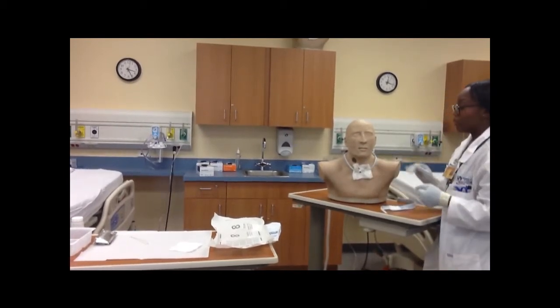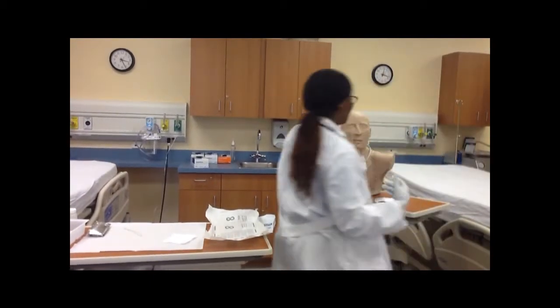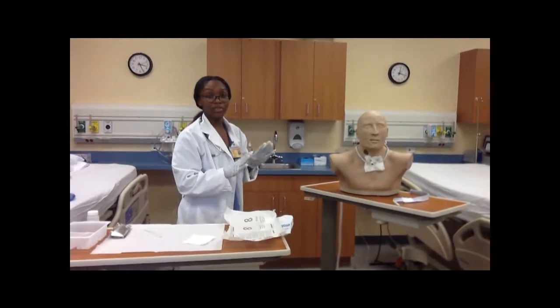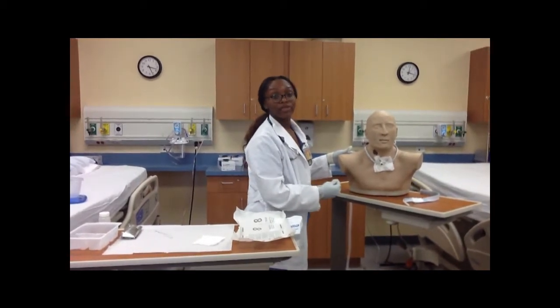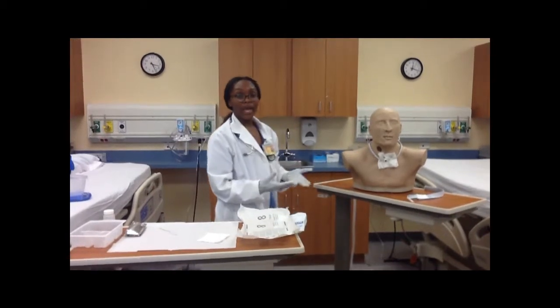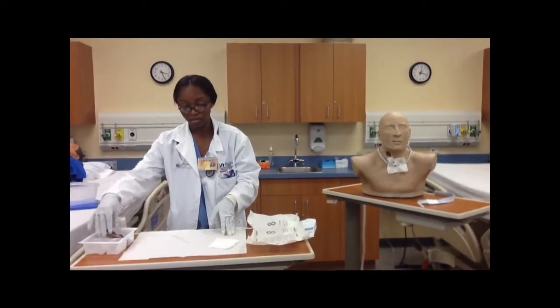Make sure that the Velcro doesn't catch on the gauze so there isn't any discomfort. Now once everything is done, I ask the patient, is there anything that I could do to make it better, or does the patient have any discomfort? And also, I assess the patient's vitals and breath sounds once more prior to completing. And if the patient is okay and everything's ready to go, I just pack up everything.